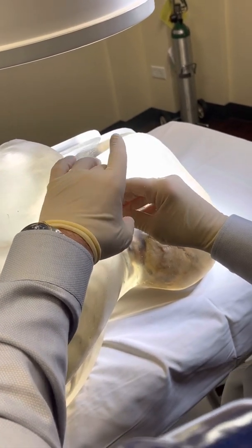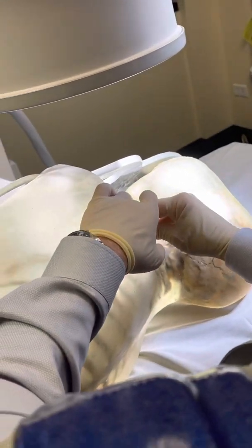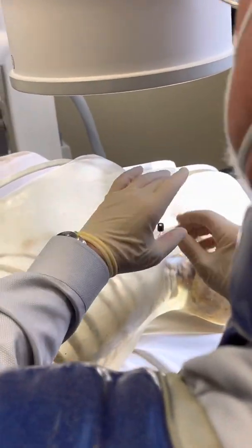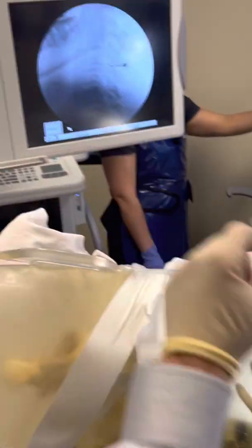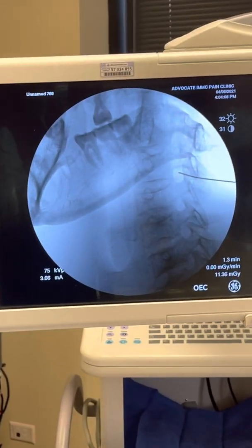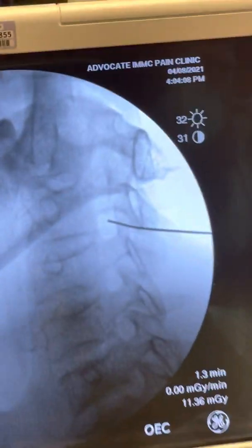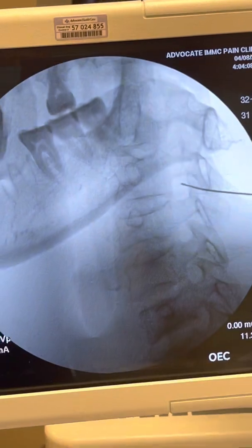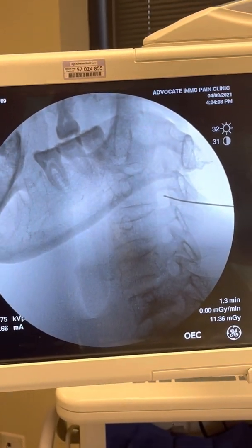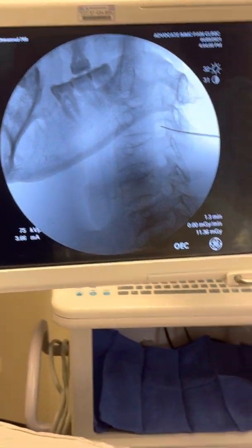I'm always assessing the patient verbally. You can see that the needle is actually exactly where I would like it to be — in the cephalad and dorsal part of the neural foramen. I'll now request a posterior-anterior view.